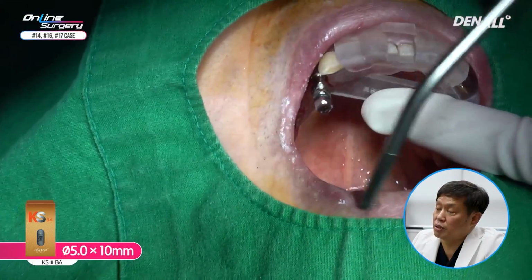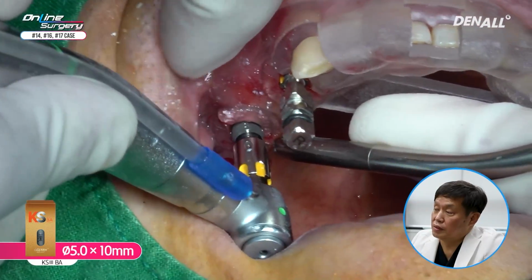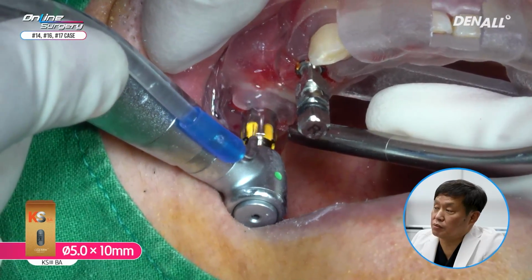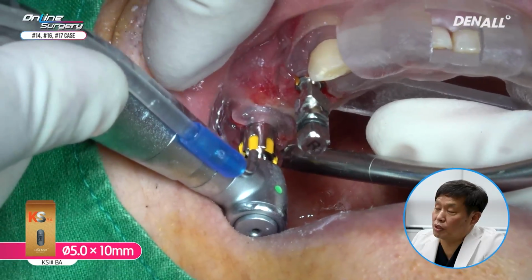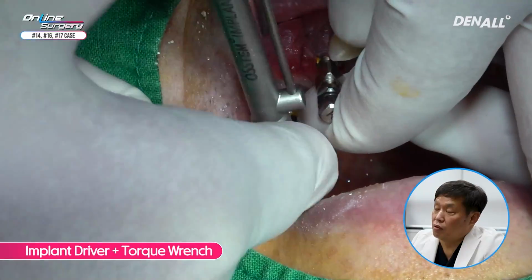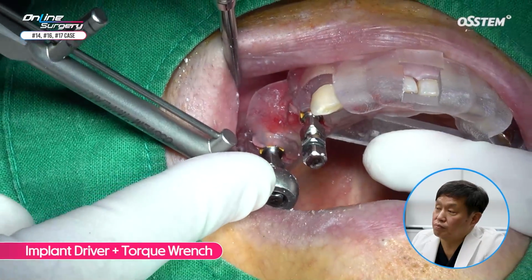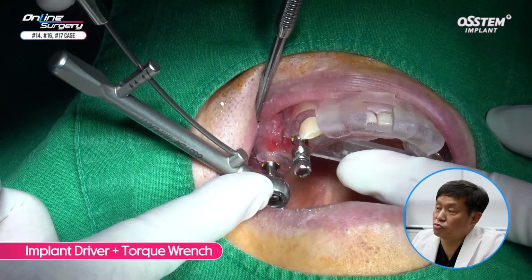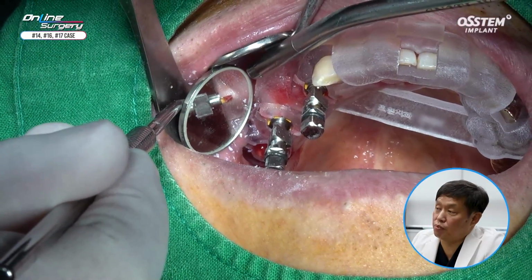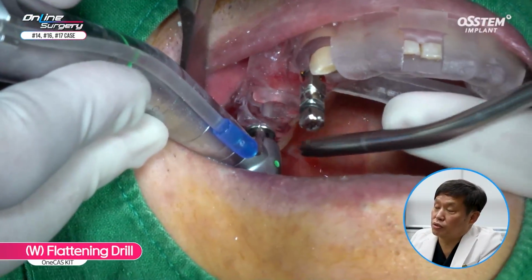KS3 5.0 by 10 millimeter implant. The implant was placed 80% using engine. More so than thought, bone quality was in favorable conditions, so torque wrench was used to adjust the final depths. Primary stability seems sufficient. Over 30 newtons of primary stability was achieved. You can see the triangular portion of implant driver.